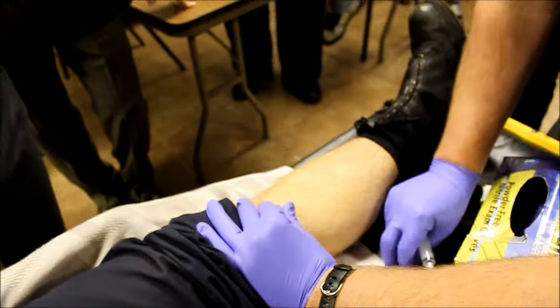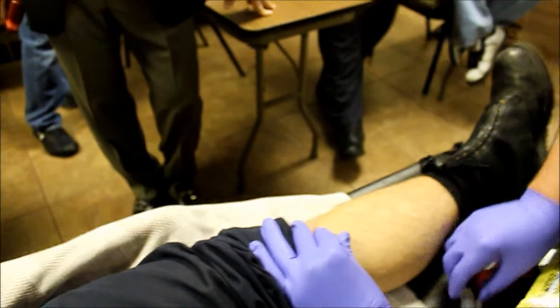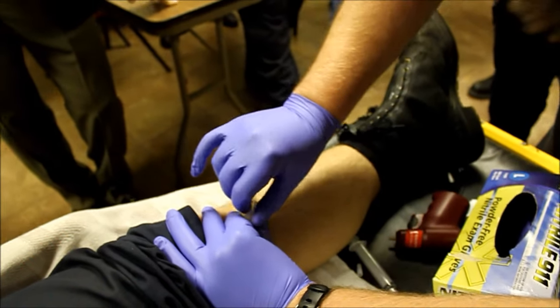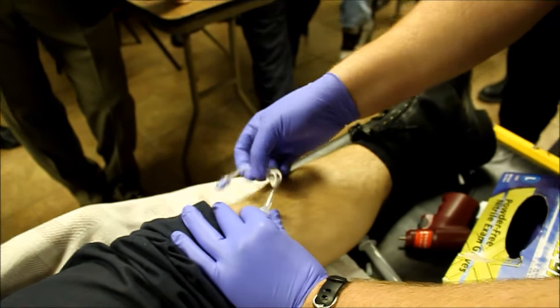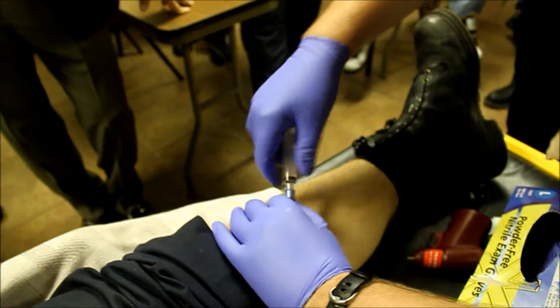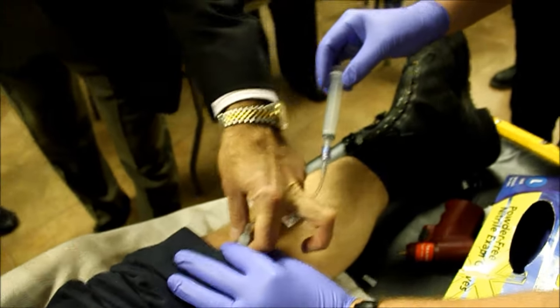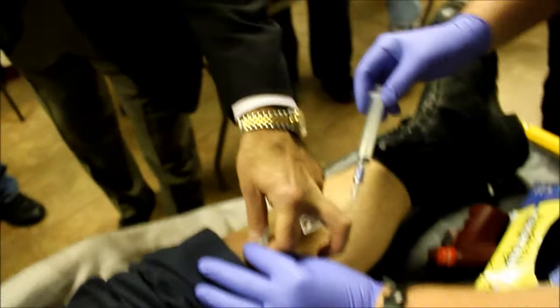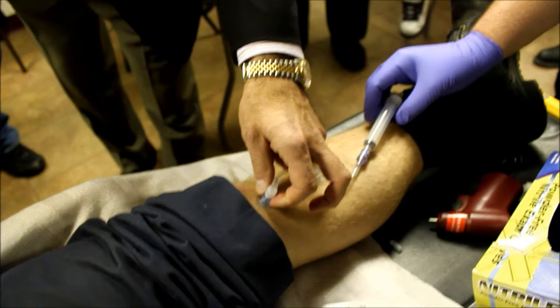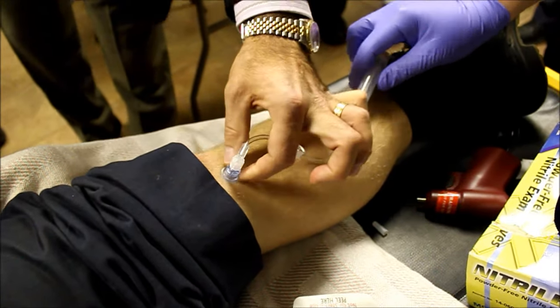You can try to aspirate — it's not supposed to happen, actually. Let me drill you in the sternum. You can't use the drill in the sternum; it's not FDA approved for sternal use. Even with Jerry — do you want him to aspirate a little bit? You want to try it? So the first thing you do is make sure you're firmly embedded. So he's in there. Does that hurt when I move it? No, not really. See his leg moving back and forth? I'm in there — it's embedded in the tibia. So it's a good spot. It looks like he's pretty good, and he's perpendicular to the bone.